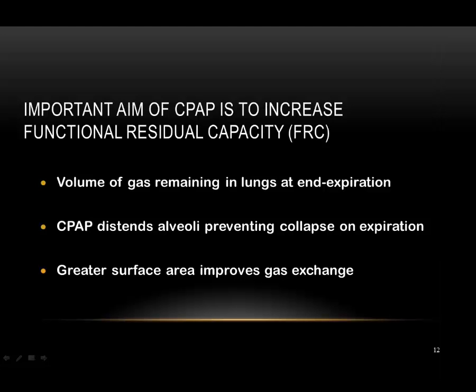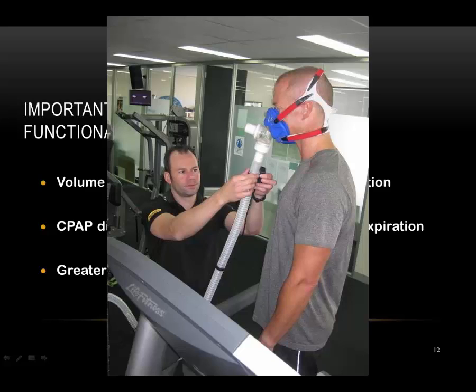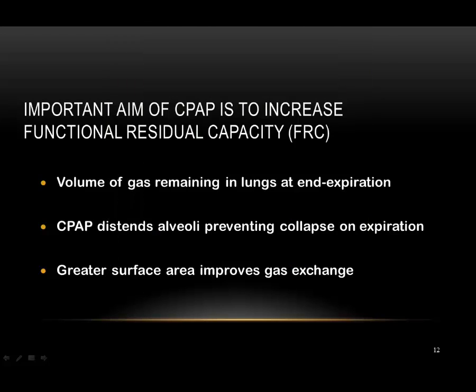This increases oxygen levels in the blood and decreases carbon dioxide levels, as long as the respiratory diffusion and pulmonary perfusion dynamics are working properly. This reduces hypoxia and reverses hypercarbic ventilatory failure. Greater saturations are possible without increasing the FiO2. In a study in which CPAP was given to fit athletes in 1979, the study reported that, in all subjects, FRC increased proportionally with the level of CPAP administered. This was accompanied by a 45% reduction in their inspiratory work of breathing.